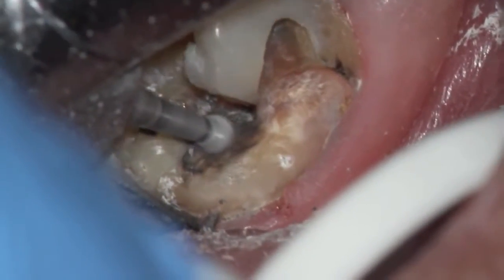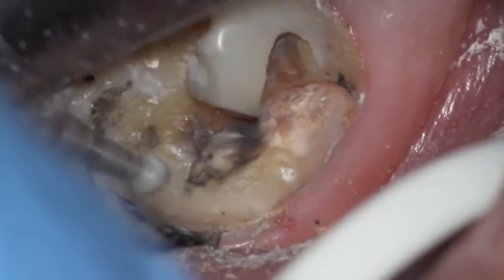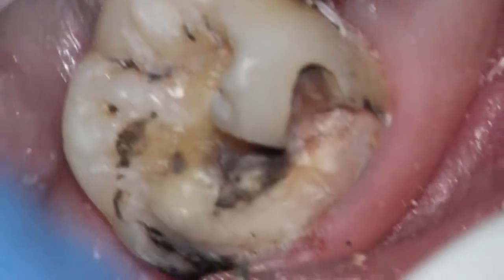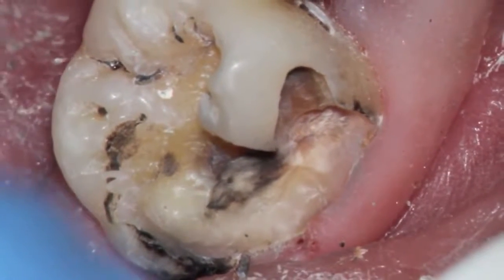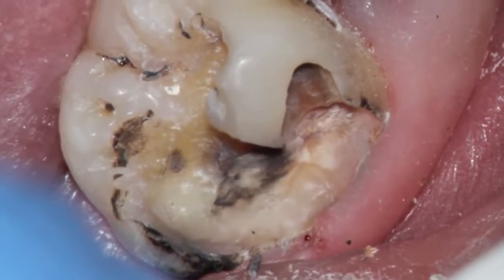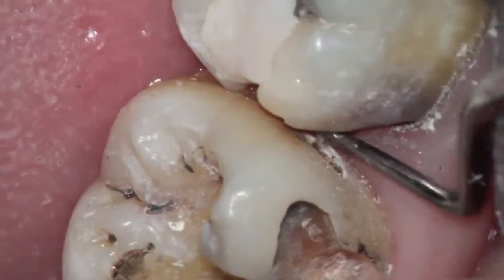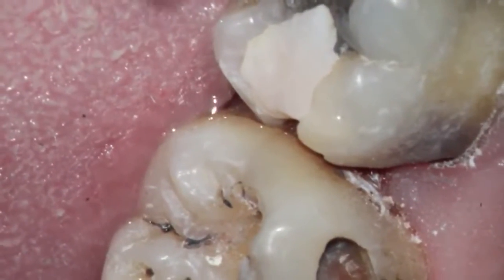And there's removal of the actual decayed area. Not everything that's stained is decay. Really, the idea is to remove only the affected area, which is soft, and to leave the non-affected area. And when you get this close to the nerve, you will find that oftentimes the tooth will get into the nerve right there in between the teeth. There's another cavity of good size.